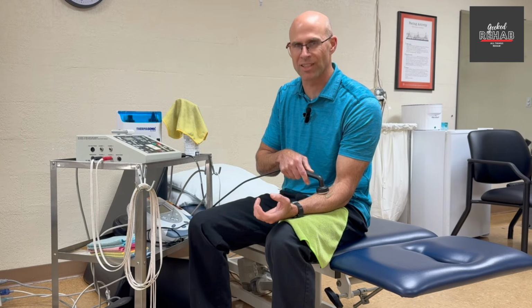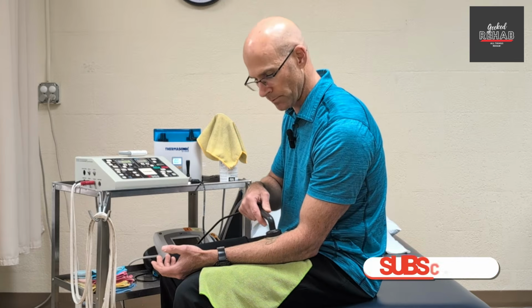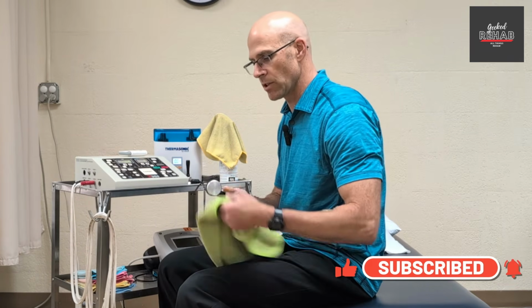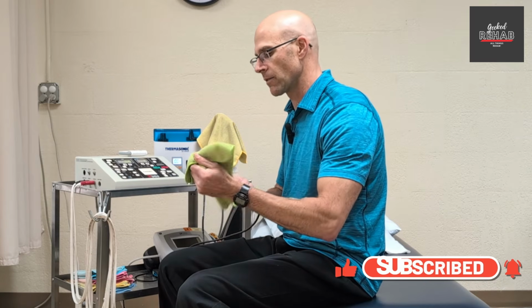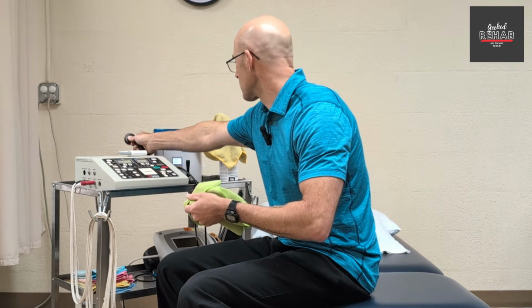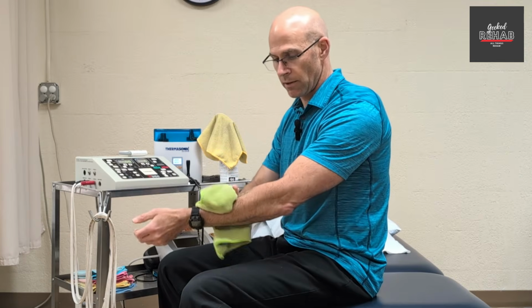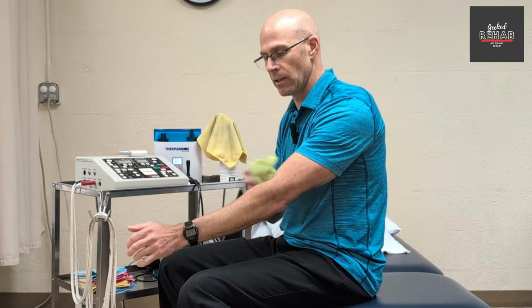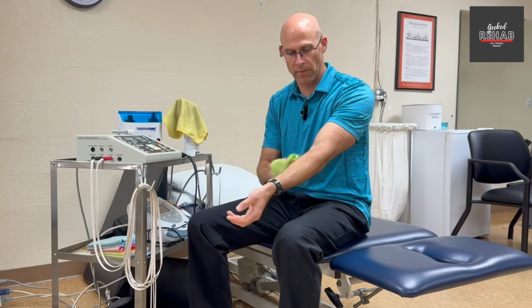And again, if it's accumulating too much, you'll know it. You'll get a deep ache. It won't be hot or heat. You won't feel that. It'll just be a deep ache, and then you just have to move it around a little bit. So anyways, that's some of the usages for ultrasound. I think it has its effective area in treatment. It's very relaxing and can feel good when it's done correctly and applied in the right format.